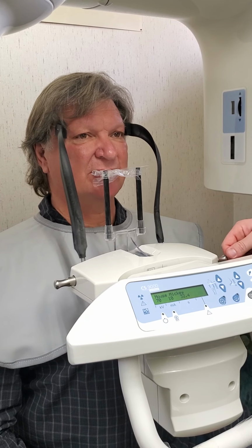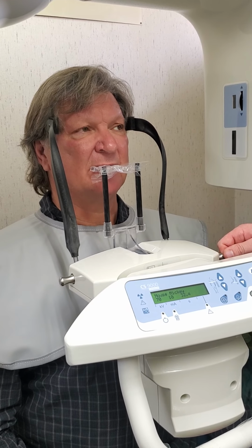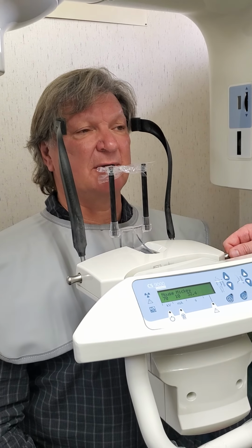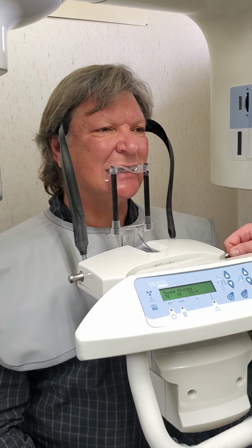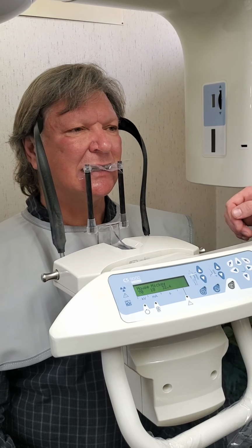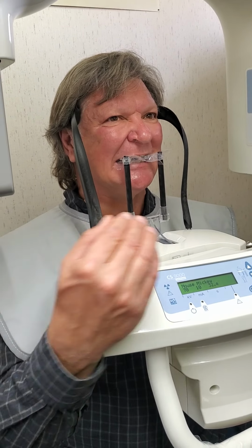And maybe that's a question to ask. Can you feel like you're biting on your front and your back teeth? Okay. Because when you did it the first time, I couldn't feel my front, but when you moved me back that time, I could feel it. So maybe you weren't biting. Come forward, bite, and slide back, because that ridge will catch behind the front teeth. No, I'm really straight.